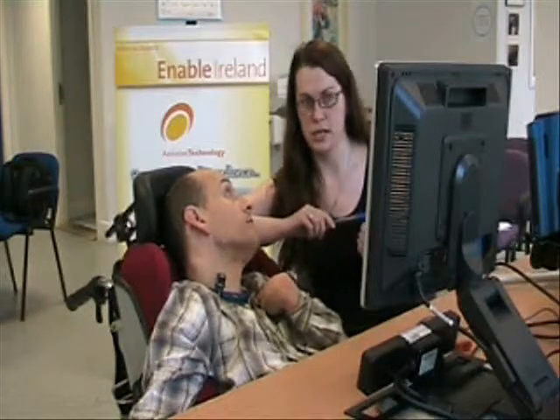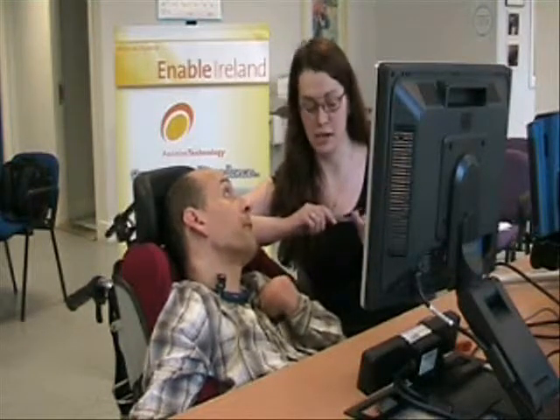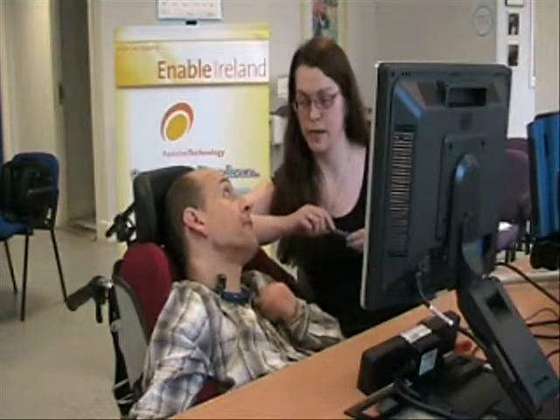So again, the first thing we're going to do here is look at calibrating the screen, or just calibrate the device so it can follow your eyes accordingly.